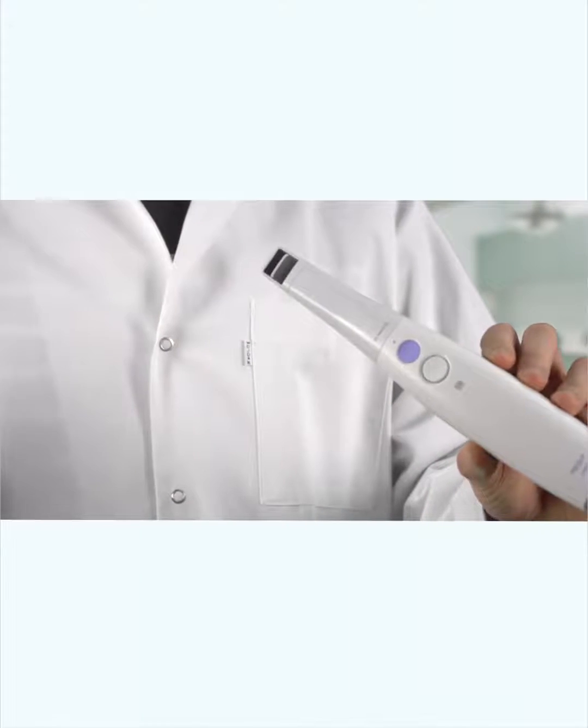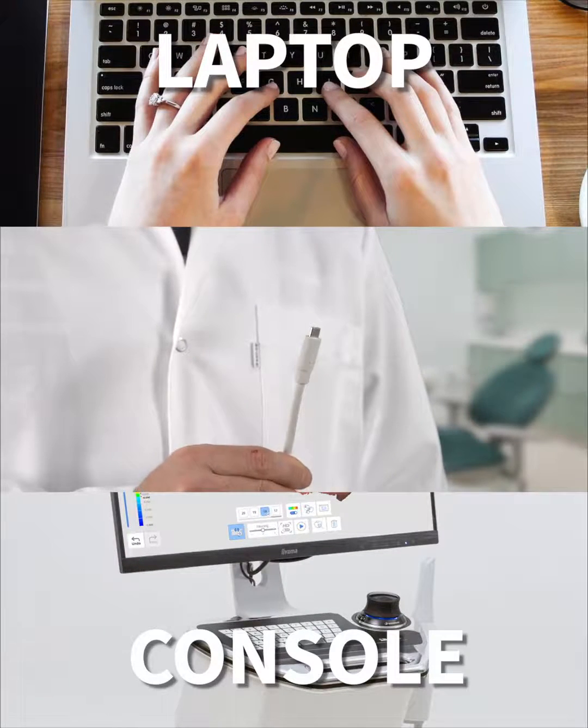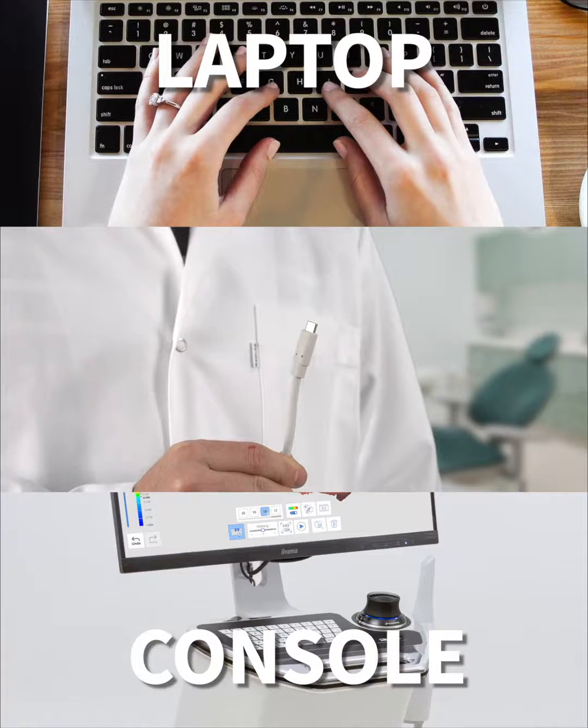Got an intraoral scanner? Well done, but you still need extras. It requires an effective PC. You can choose between a laptop or a professional console. Let us have a look.